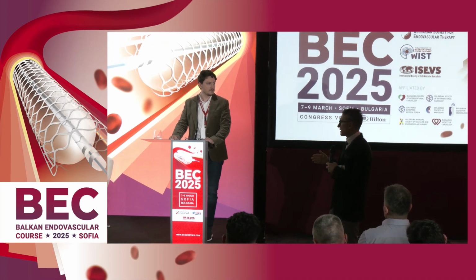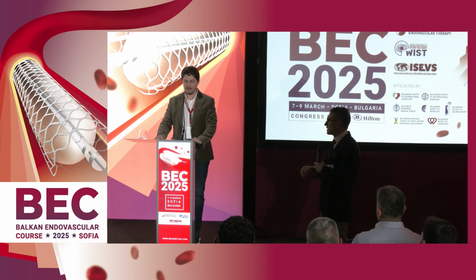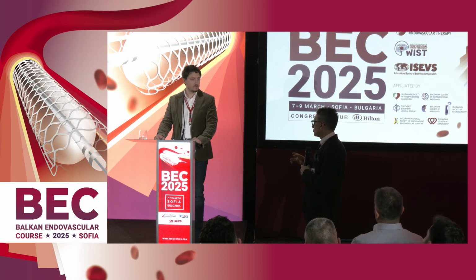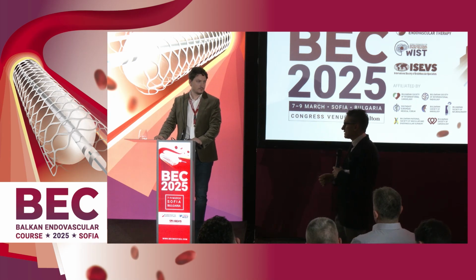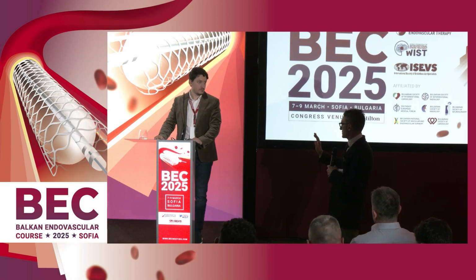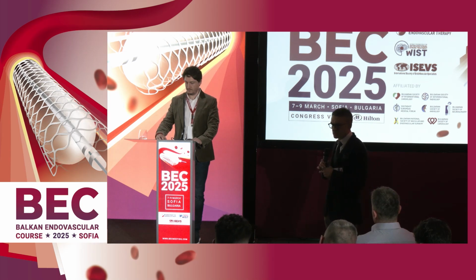But all this armamentarium, microcatheters, drug-coated balloons, everything is, in fact, intended to improve the flow of the artery. And if two arteries are going to the foot, better. So I showed yesterday by the thermography that we are utilizing, it's like a perfusion showing technique, that it's better to improve, especially in patients with wounds. Congratulations definitely for the cases. They are really very thoroughly, very well done, and this is the right behavior.